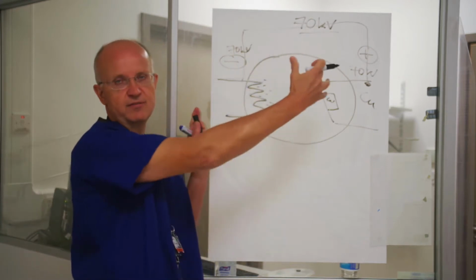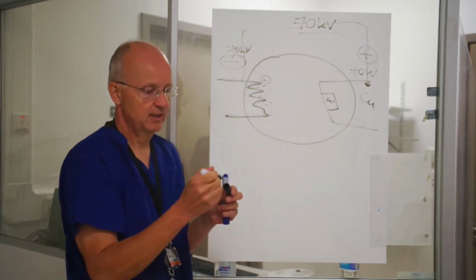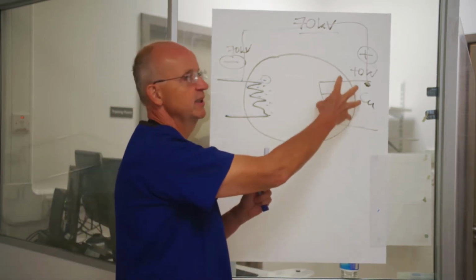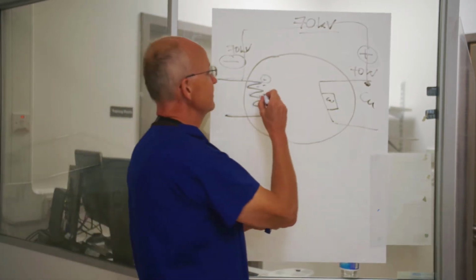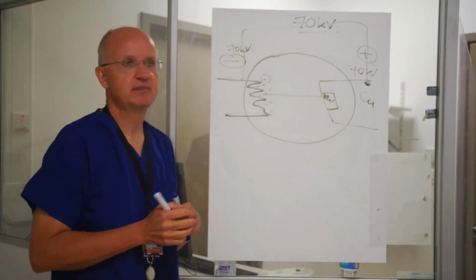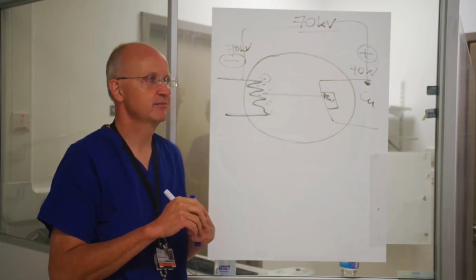So there's a huge difference in the two. And if you're a negatively charged electron, what are you going to do faced with this lovely big positive charge over here? You're going to go racing across, and you will hit a big lump of immovable object. So what happens at that point?